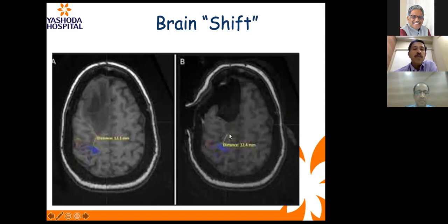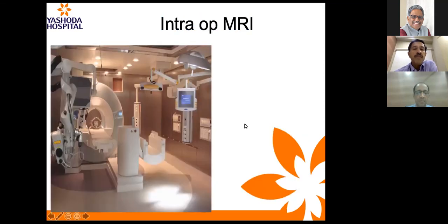intraoperative, a big tool. Not only MRI, you may use intraoperative ultrasound, which can be useful, which has its own limitation. Intraop MRI definitely is expensive, but can be modified as we have done over at our hospital, where the patient can be in the next room. Unlike this brain suite where patient and the magnet is in the same room, we have an adjacent room and when the operation is done, we can wheel the patient into the MRI whenever required.